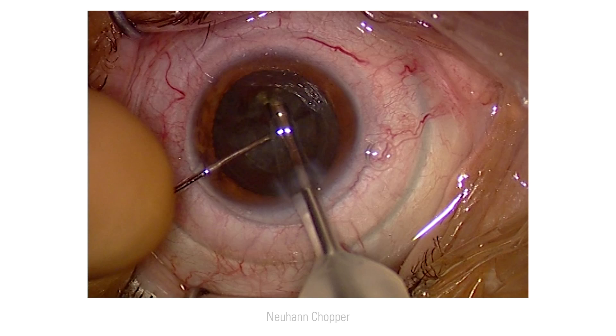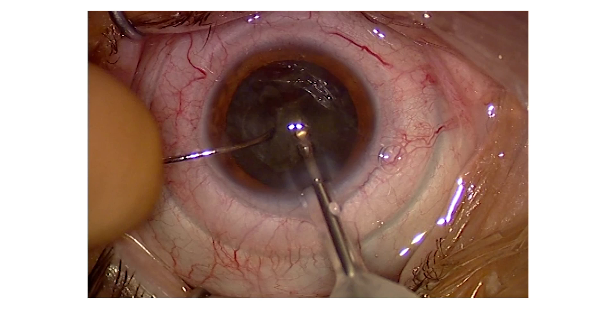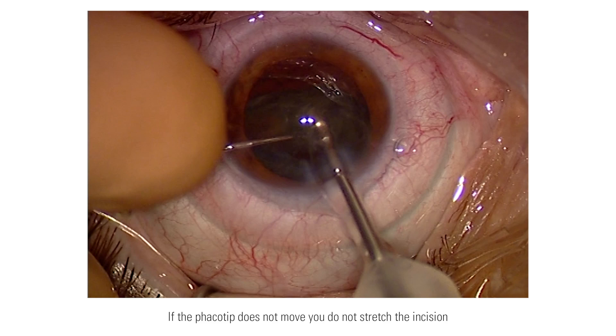The Neuhann Chopper has a round tip and is therefore harmless, preventing intraoperative trauma at the capsule. I use a stop and chop method. The phaco device allows me to use a high vacuum up to 600 mmHg, so I can easily mobilize the pre-fragmented nucleus. This, together with the laser fragmentation of the lens, enables a low effective phaco time. An important factor is not to move the phaco tip during surgery; I deliver the segments to the phaco tip so I do not stretch the main incision and it remains watertight.